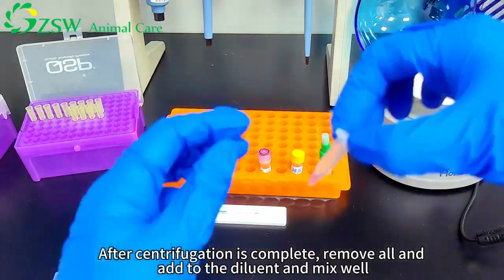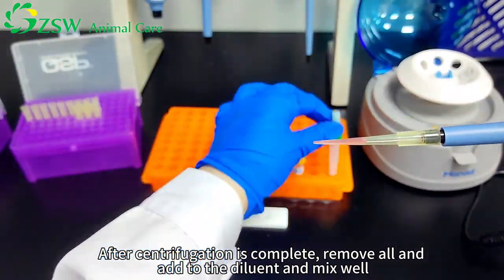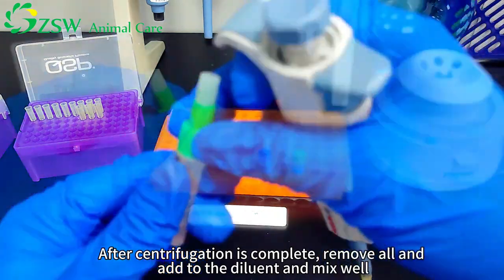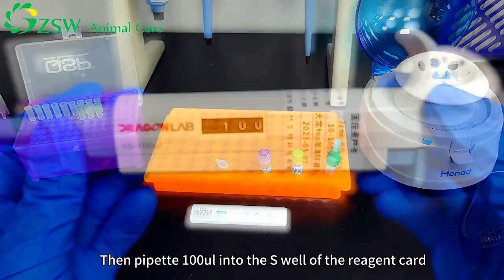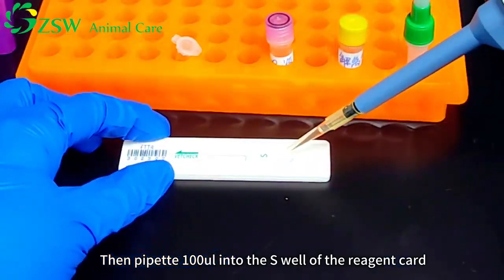After centrifugation is complete, remove the supernatant and add to the diluent and mix well. Then pipette 100 microliters into the S well of the reagent card.